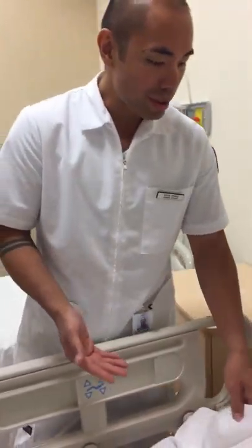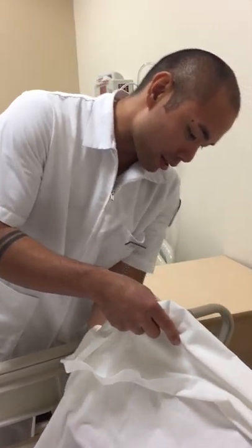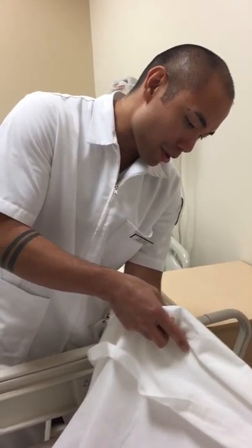So I entered the room, washed my hands. I'm going to identify myself to the patient and identify the patient, also making sure that this table is locked and secure. My name is Brian, I'm going to be your nurse today. Can I verify your first and last name and your date of birth? I look at his wristband, I confirm. Thank you, Mr. Alvarez.